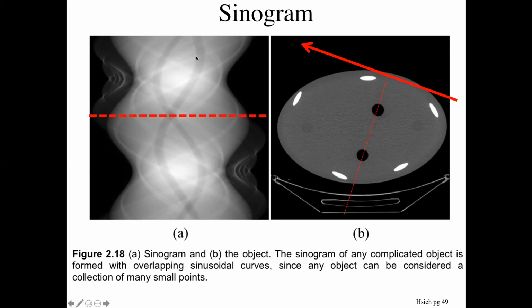Here is where the two dark features, as we're moving through theta, there will be a theta in which they are aligned and they're the same size. And so wherever they cross, that's going to be that angle, right? And so that's sort of how you can look at these sinograms and figure out what is what in there.